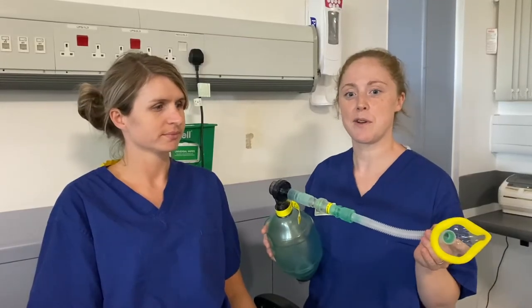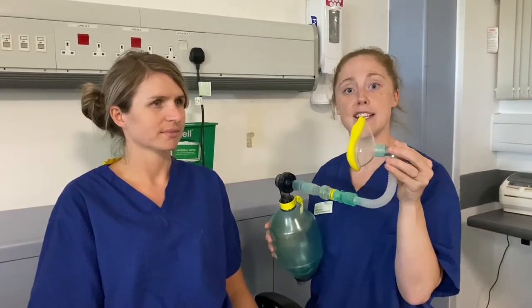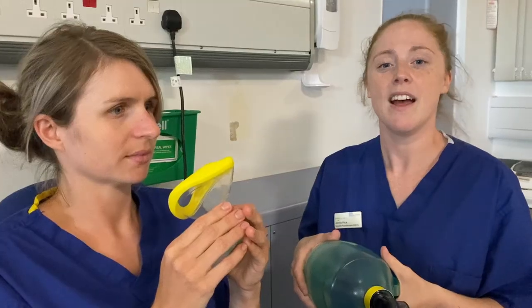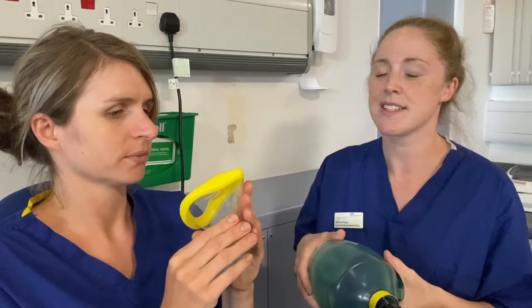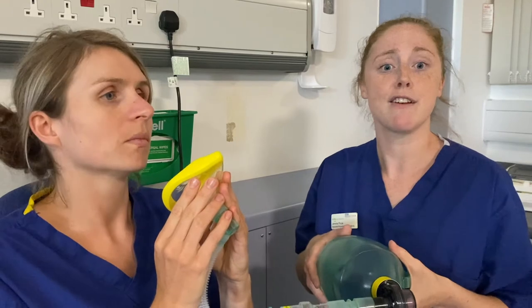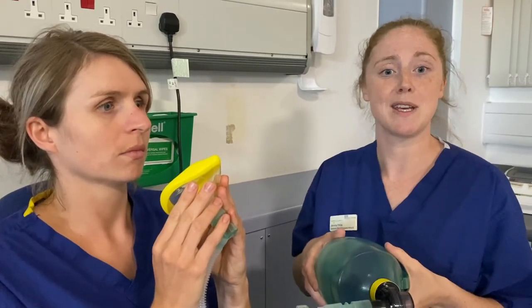We'll now demonstrate the Lung Volume Recruitment Bag with Katie using a face mask. Depending on the function of your upper limbs, you're able to either hold the face mask yourself, or your physiotherapist can train your carer or family members to do so. I'm now going to ask Katie to place the mask over her face. Once she's got a good seal, we're going to take a series of smaller breaths to equal one large breath.